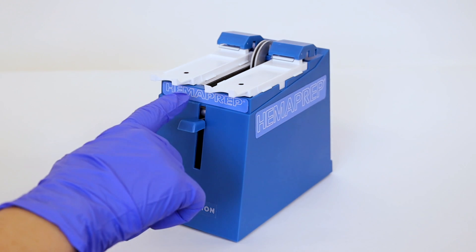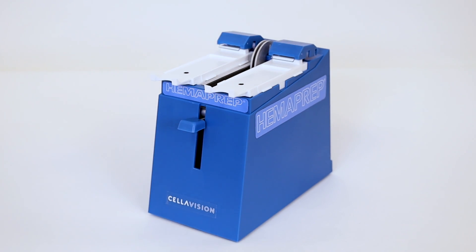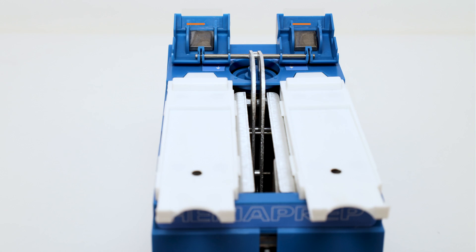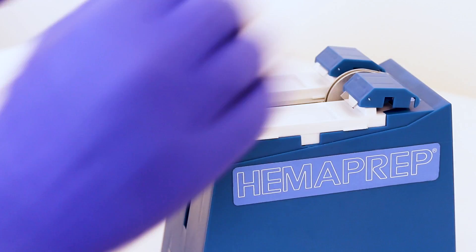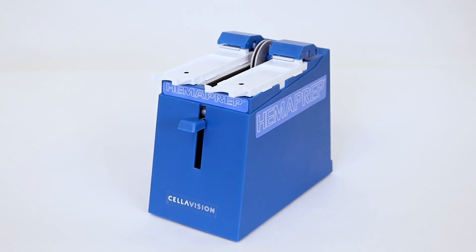Before you start using your Hemoprep, be sure to press and release the plunger to make sure the spreader blades are aligned. Each day before use, look inside the spreader arms and check that the weights are attached correctly. When finished, press and release the plunger to align the spreader blades.